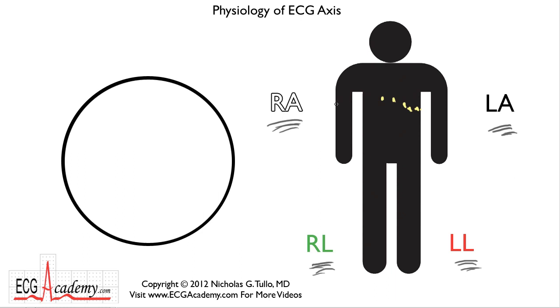Lead 1 records electrical differences between the right arm and the left arm. Lead 2 records electrical differences between the right arm and the left leg, and lead 3 records electrical differences between the left arm and the left leg, creating a kind of a triangle which is known as Einthoven's triangle after the fellow who did much of the early work in electrocardiography. The right leg is generally used as a ground just to help eliminate some of the electromagnetic interference that these recording systems can pick up from the outside world.